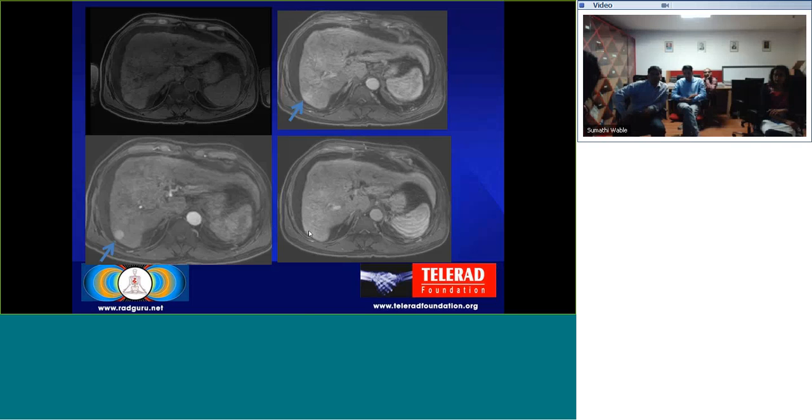So that's why we used to do 7 minutes, because I don't know if you remember, biliary carcinomas are supposed to retain contrast. And sometimes we can get a mixed biliary and HCC in these patients. So we wanted to catch that also. That's how we picked the 7 minutes.